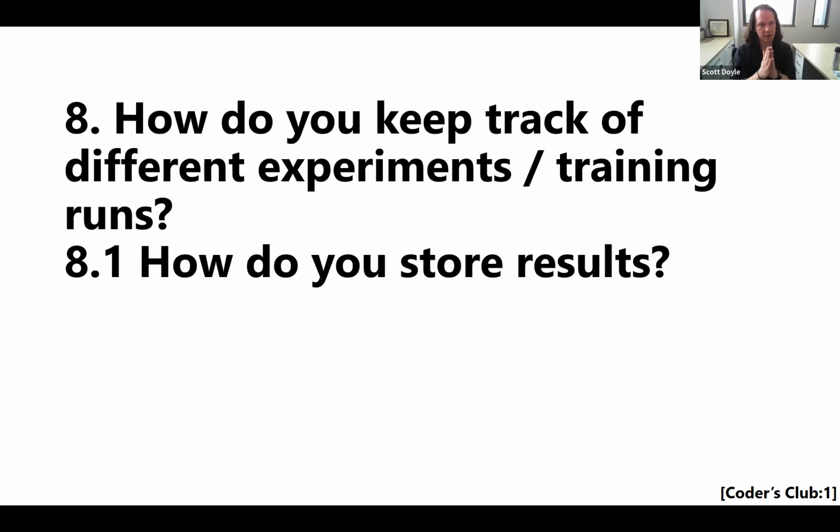As the criteria or the metrics that you're using change over time, you go from, I want an algorithm that just works, to I need an algorithm that subdivides these classes and provides different performance metrics for each class, or produces a confusion matrix. I need to see the train validation curves. I need to see examples of the maps of the outputs. All of these things come about as the project develops. And so I tell my students to save everything and have scripts that will generate outputs and artifacts that we can use to examine during our research meetings to see, are you improving the model? Are you getting better results, and so on?